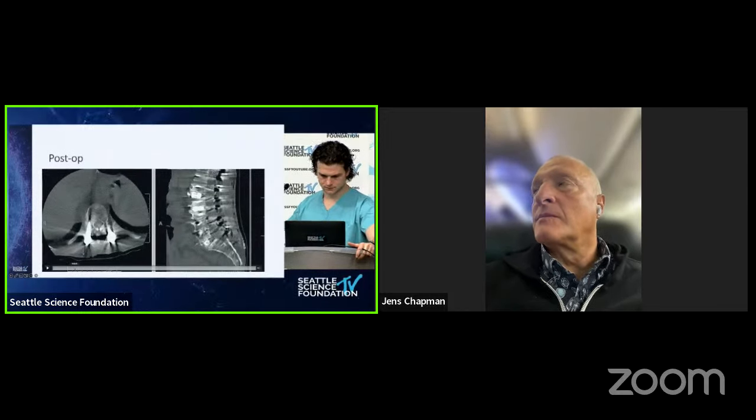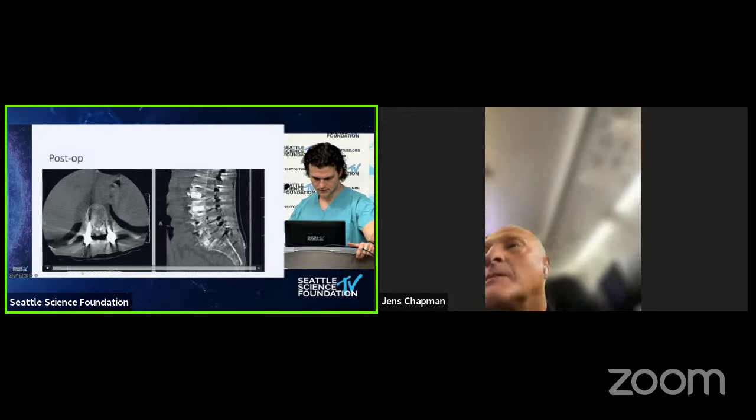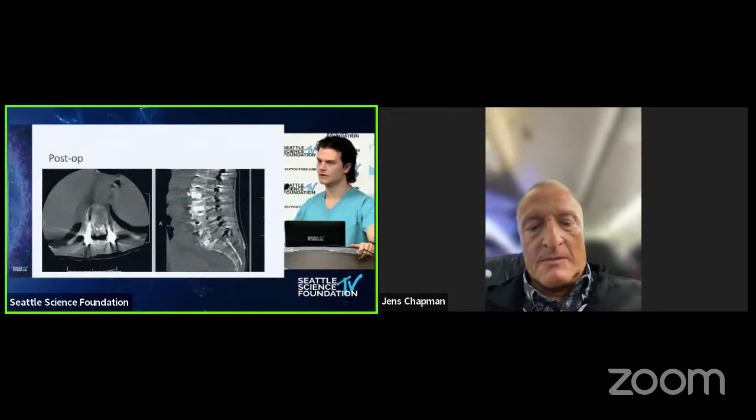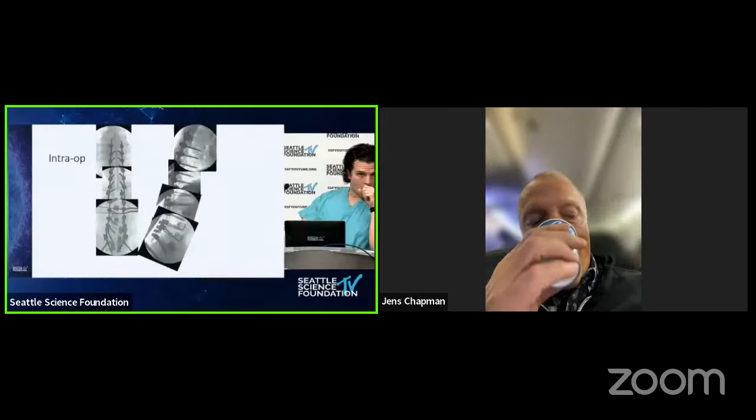Was that a bilateral T-lift that you guys did there, Jens? Yes, sir. It was bilateral at 5-1. Great. Is there a coronal? There we go. Okay, so bilateral at 5-1, and then unilateral at the other levels.